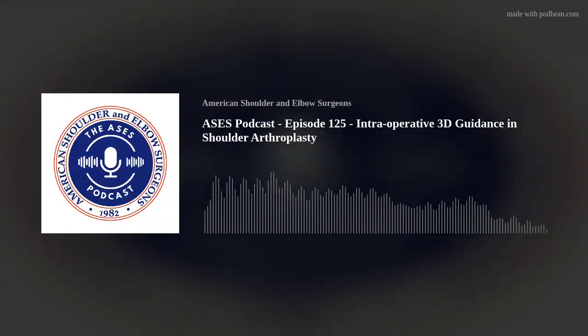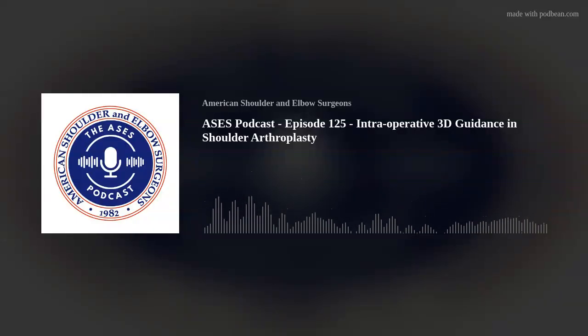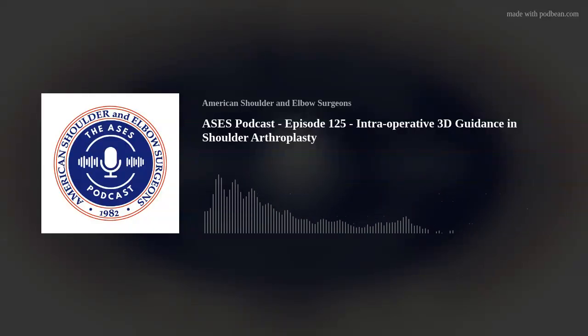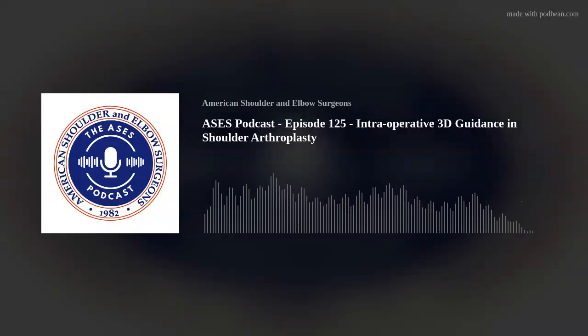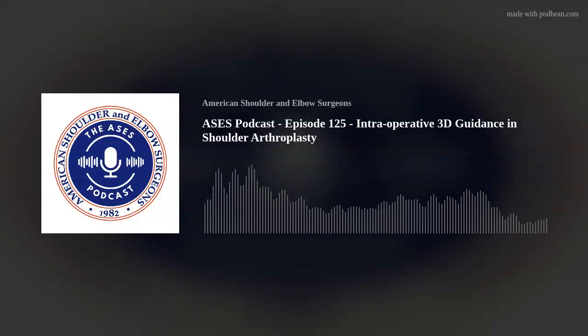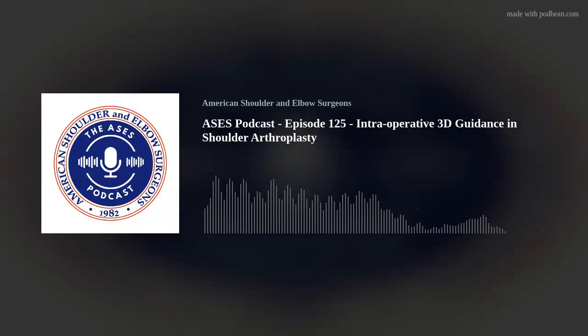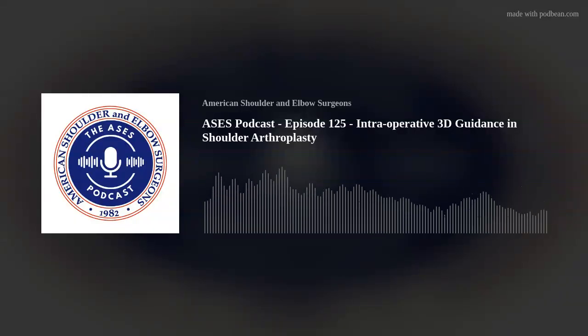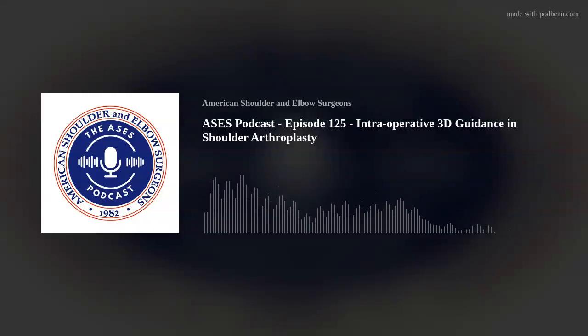To Rana's point, the robot right now requires an excellent exposure. There's a lot of moving parts. It's probably actually a little bit more challenging to do a robotic total shoulder in the current state. We're certainly working towards making all that more user friendly, so I don't think we've achieved that ease of use yet. And the third thing is that it should be able to make shoulder arthroplasty a minimally invasive procedure, mainly a subscap sparing operation where we don't have to see things as clearly as we would otherwise, and we can trust that the robot's going to be able to do a good job.